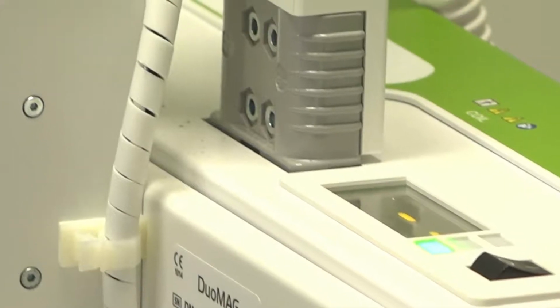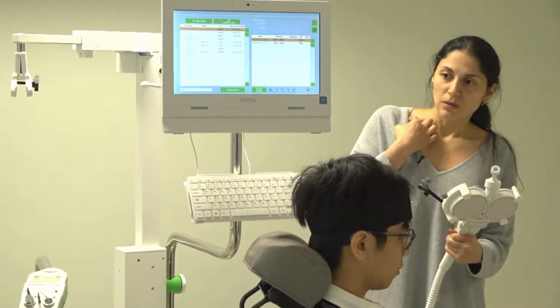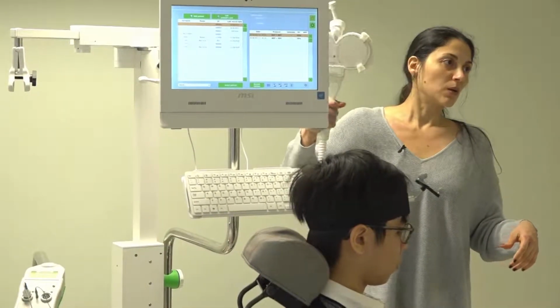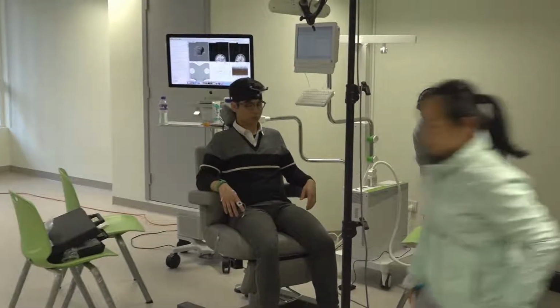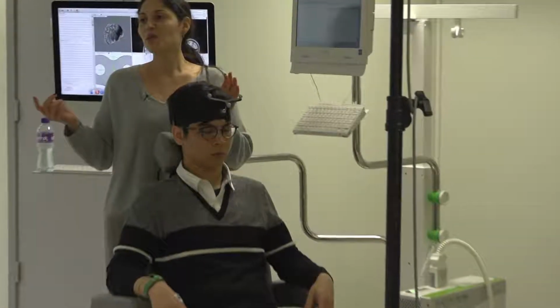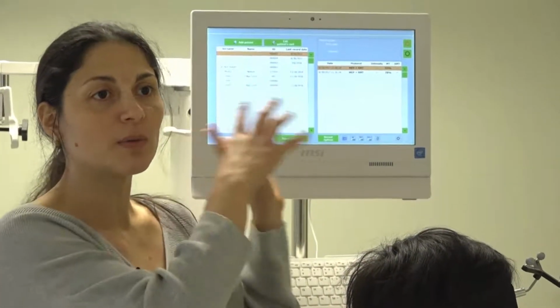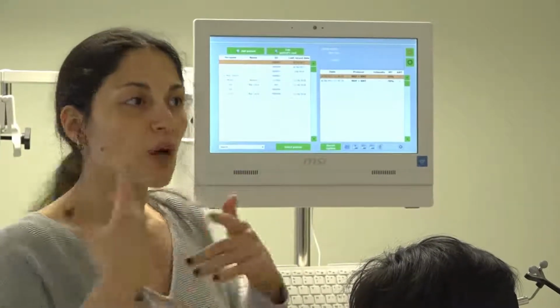And I want to put this in a chair. Can someone bring a chair here, just please? Thanks. Because you don't have a coil holder, so you need to be careful with this. Thank you. Let's put it here. And let's check this thing here. With another equipment, it will be a lot easier. Just switch on the machine, put it here, and it's easier. But as we have this very modern thing, we need to do a lot of steps. And then I want you to get familiar with all the steps you have to do.